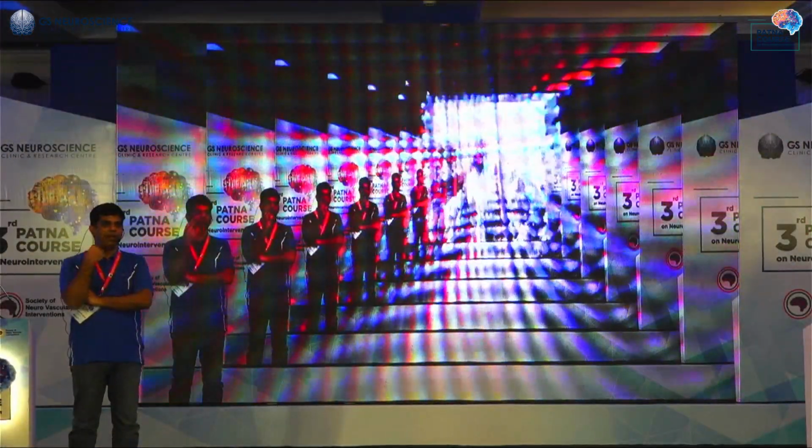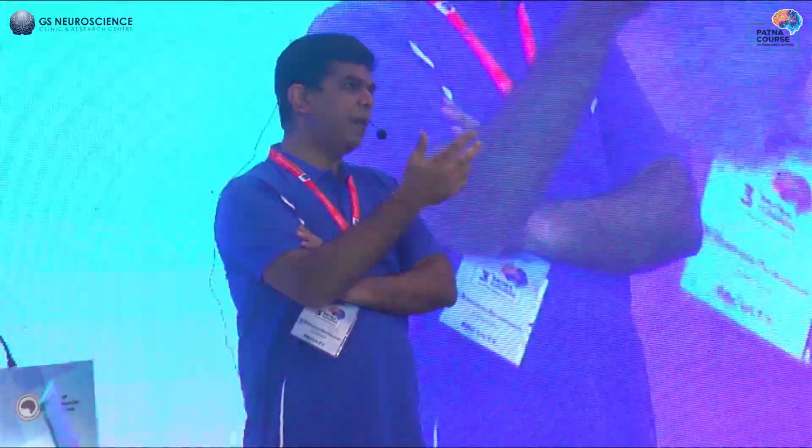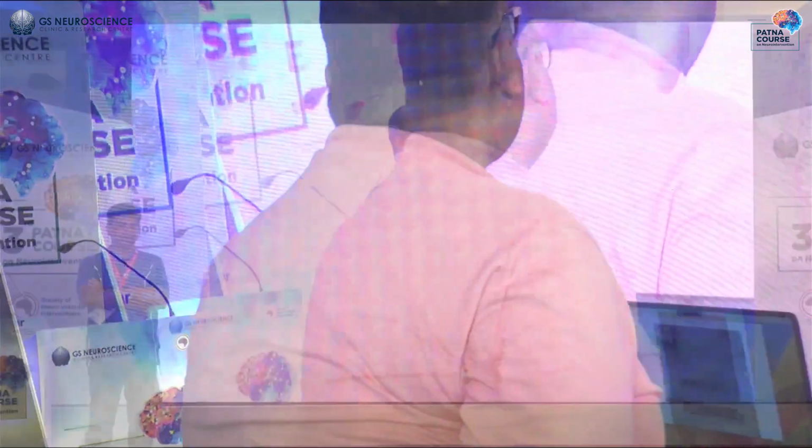So there are 2 things here. One is, different people have different philosophies. If I don't get close to the fistula, I would treat it surgically. I would go to the theater, open up and localize the point and treat it. There are some people who would inject a touch of glue and go to the theater, because that glue drop will give them a localization during surgery. Radiologically, with the C-arm, they can localize it. But I would prefer to just back out and then go to the theater and clip it or disconnect it surgically. Dr. Rahul, any tips?